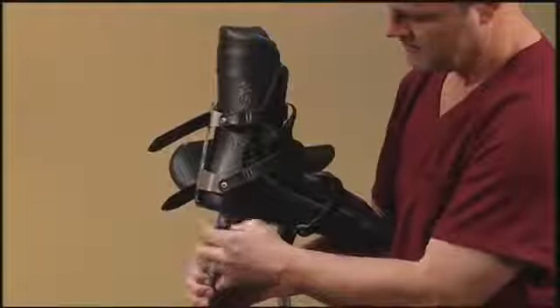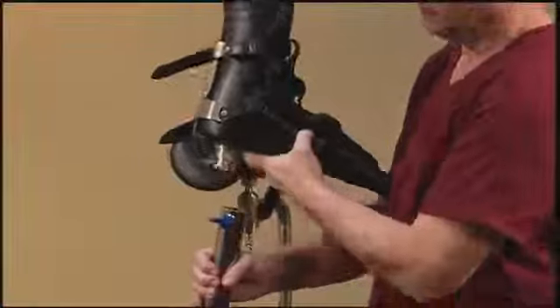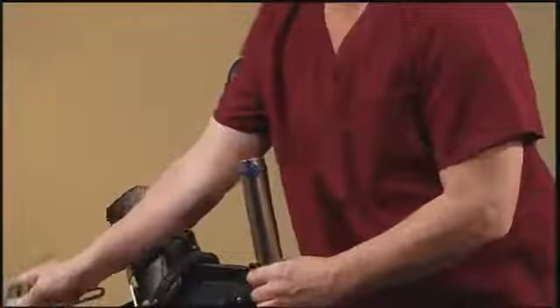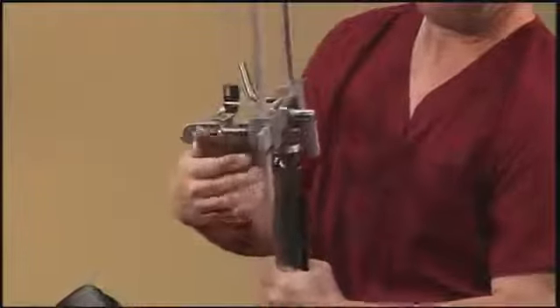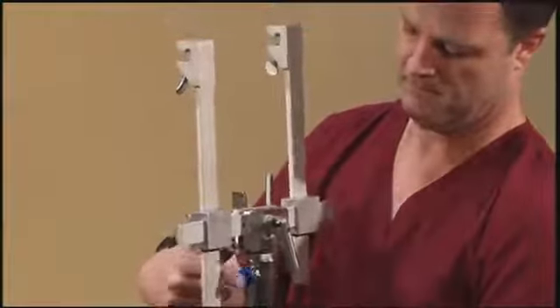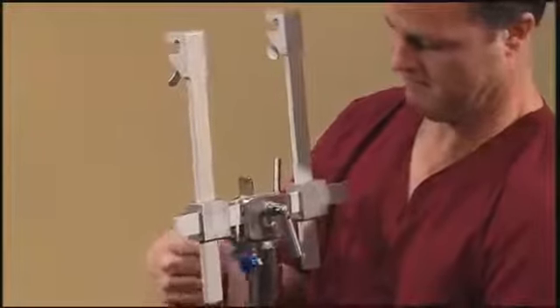If the surgeon chooses to do tibia repairs on a fracture table, the orthopedic boot must be disassembled from the traction unit. Onto that, a 90-degree pin and wire holder is attached. Into the 90-degree pin and wire holder, we will attach two ferrules. These ferrules will be covering the Steinmann pins in the calcaneus bone of the ankle.